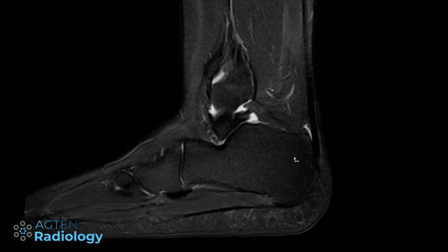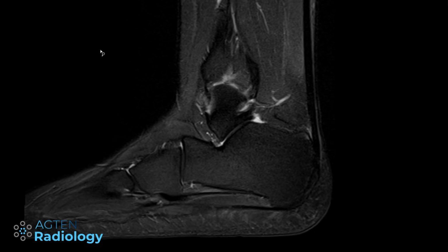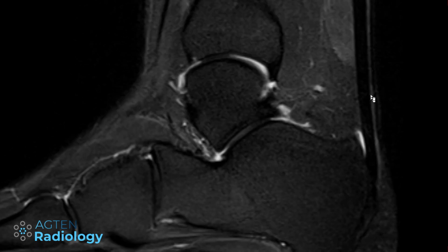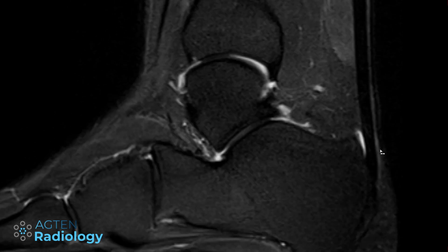Now it's a little bit borderline, I admit, but we have other signs that can guide us in this patient. So one thing is, you can see here a tiny amount of bone marrow edema in the calcaneal bone, in the calcaneus. This is a little bit too much, and also here along the paratenon of the Achilles tendon we have some edema, potentially also in the subcutaneous soft tissue. And we have a second bursa here, which is the subcutaneous calcaneal bursa, although I never really see a lot of fluid in that bursa anyways. So it might also be just a paratenonitis in this setting here.